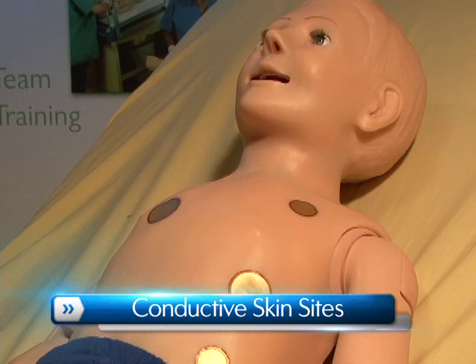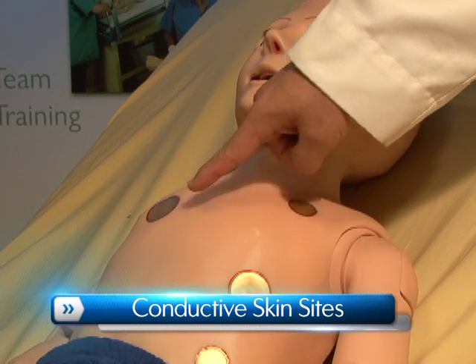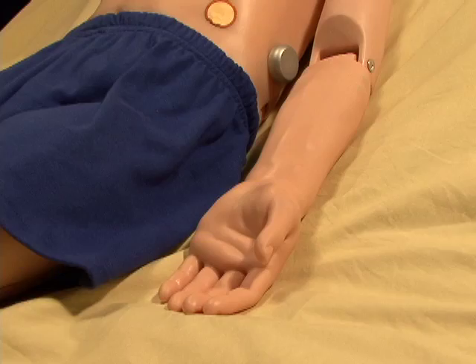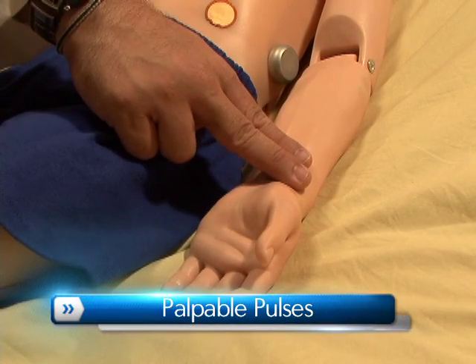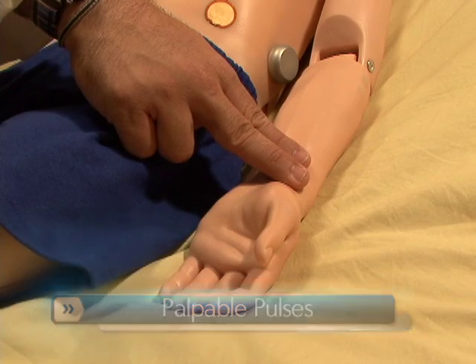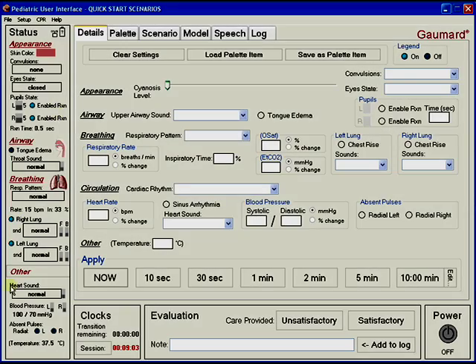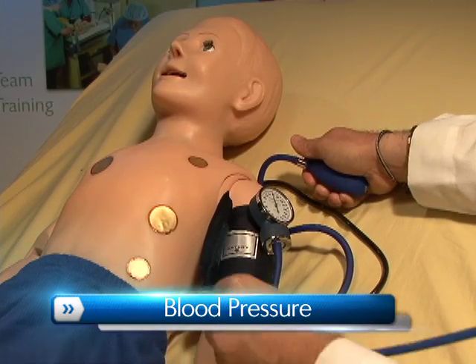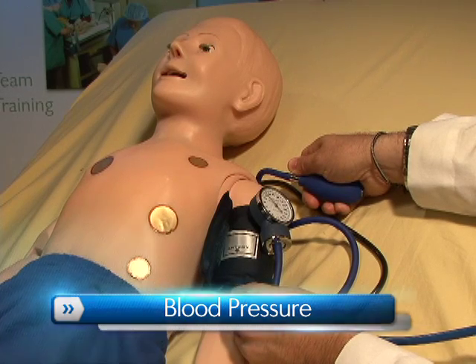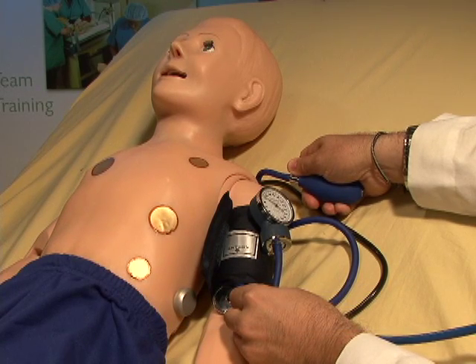Pediatric HAL's conductive skin sites are conveniently placed anteriorly to allow easy access for pacing. His palpable pulses are dependent on blood pressure, and users can also disable distal pulses to simulate severe hypotension. Blood pressure can be read using a sphygmomanometer, and users can auscultate the Korotkoff sounds.